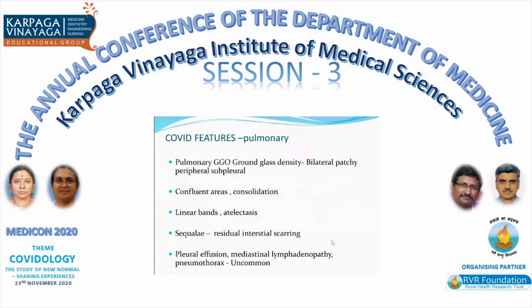So to come to the second aspect of the lecture, that is, what are the COVID HRCT features. The main thing is pulmonary: 90 to 95% is pulmonary, and only 5 to 10% would be other systems. In pulmonary, the main thing we see is GGOs, that is ground glass densities, bilateral, patchy and subpleural. Sometimes there can be confluent areas of consolidation, sometimes linear bands or atelectasis. Sometimes the sequelae of COVID can be seen as residual interstitial scarring. Pleural effusion, mediastinal lymphadenopathy, and pneumothorax are uncommon. So if they are there, then there is less chance of it being COVID.